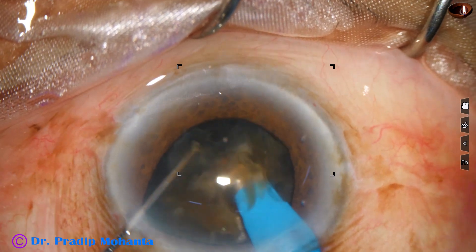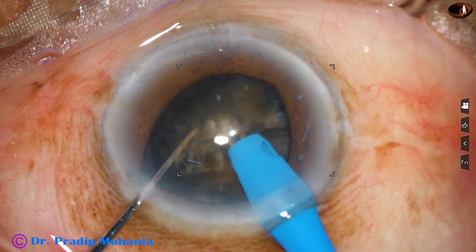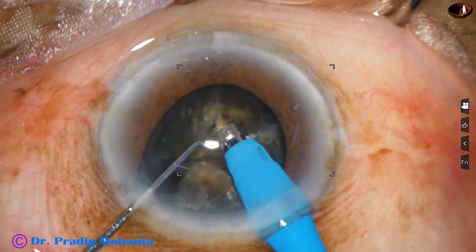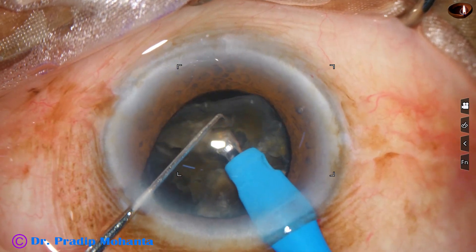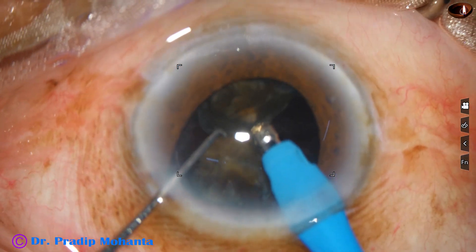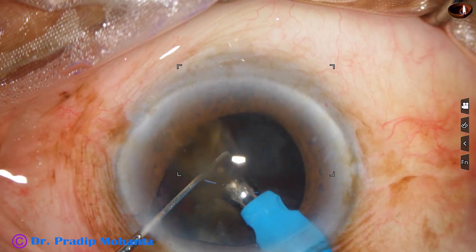One by one, each nuclear piece is emulsified. From the very beginning, ultrasonic energy is 90%, flow rate is 45 ml per minute, and vacuum is 450 mmHg. Each nuclear fragment is tilted and emulsification is started from the apex. Each nuclear piece is eaten gradually; if necessary, it is subdivided into smaller pieces. Emulsification is carried out at the iris plane in the central part of the anterior chamber, remaining always in the central 3 mm zone.